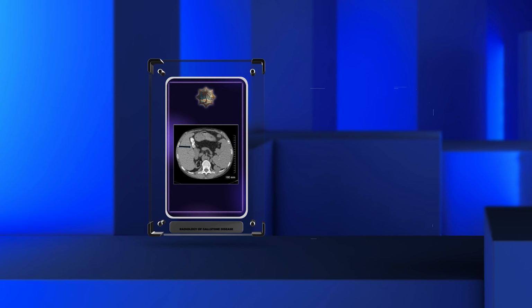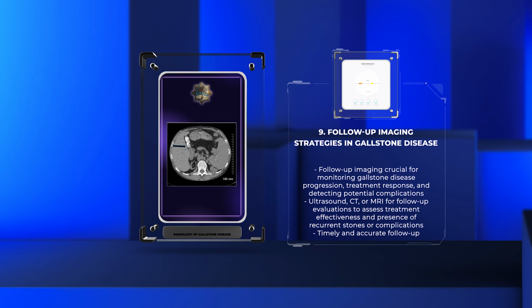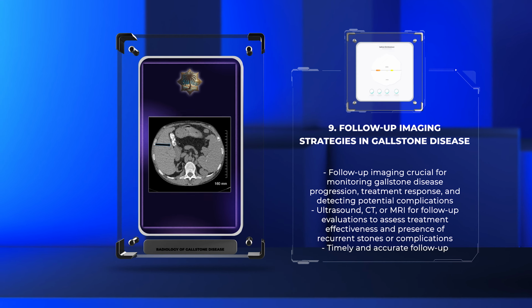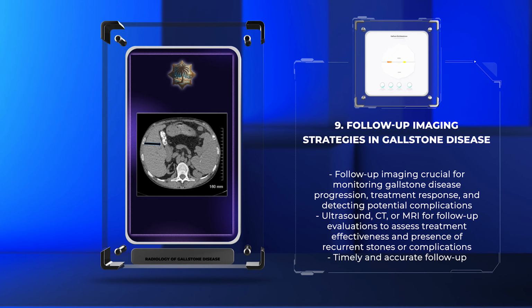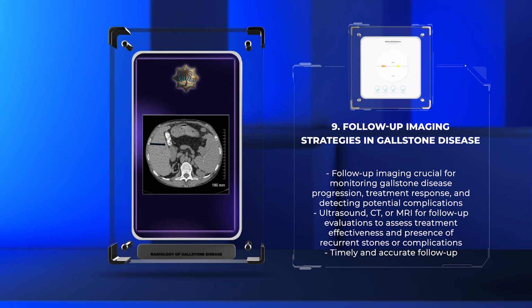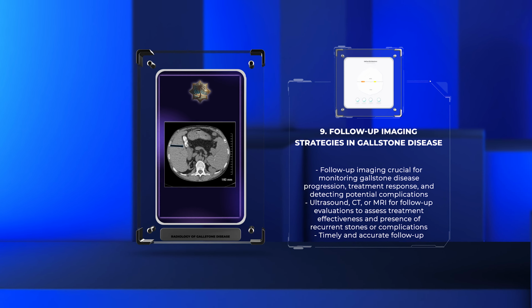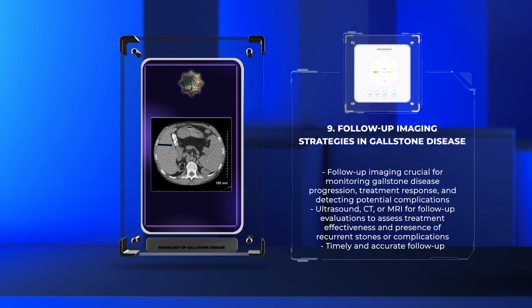Professor, proper follow-up imaging plays a vital role in monitoring disease progression, assessing treatment response, and detecting potential complications related to gallstone disease. The professor displays a series of follow-up imaging studies showing the same patient over a duration of time.